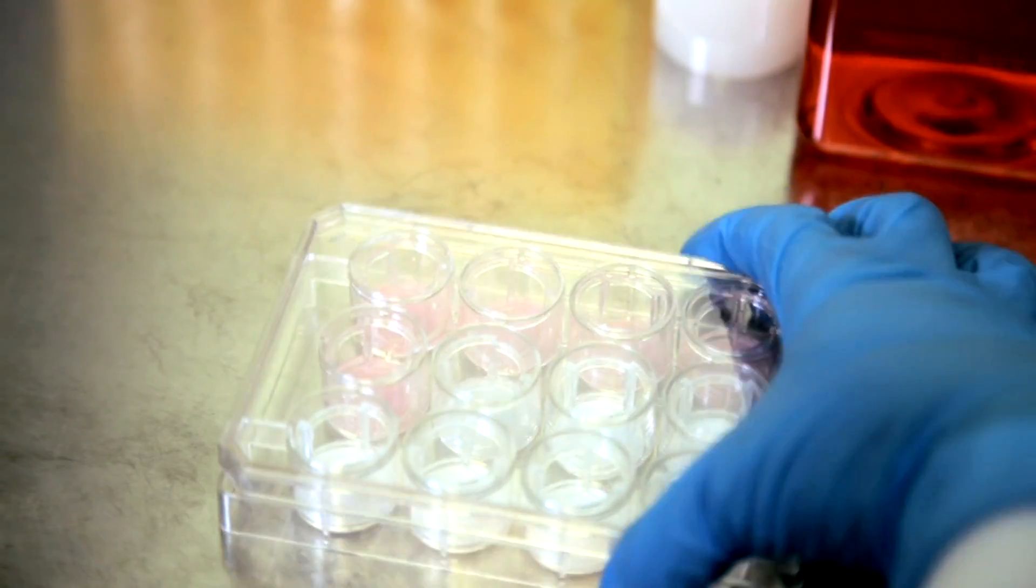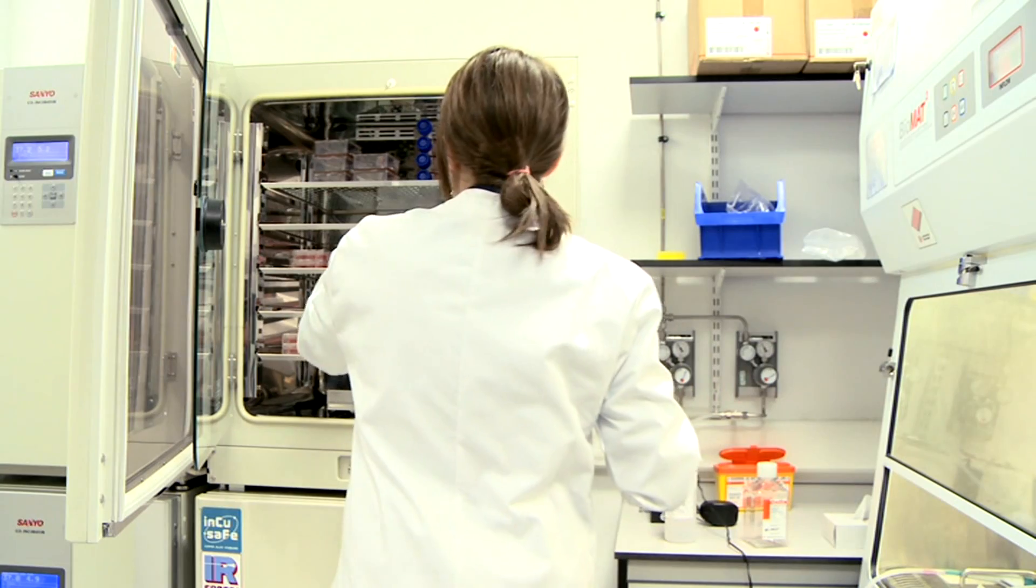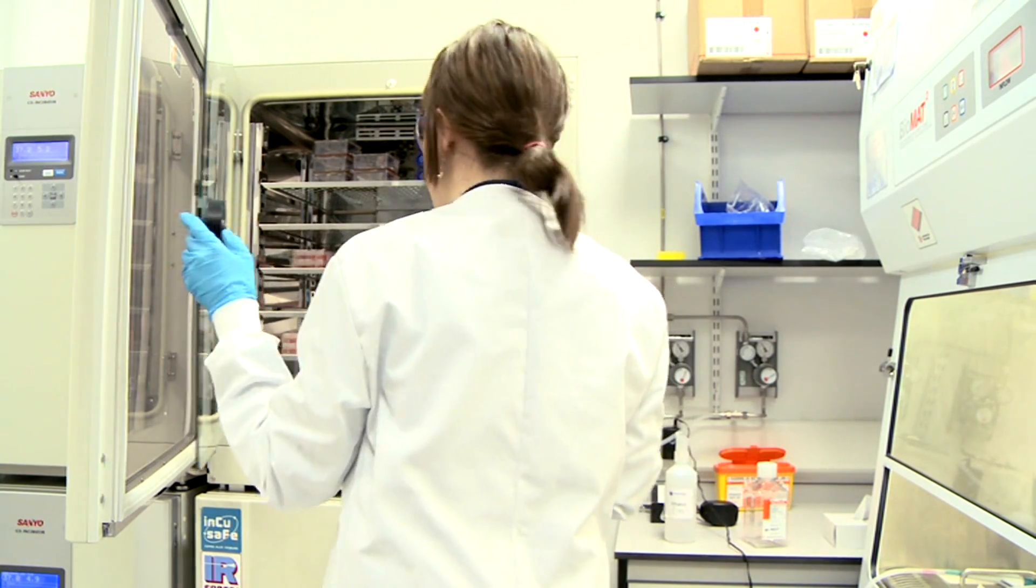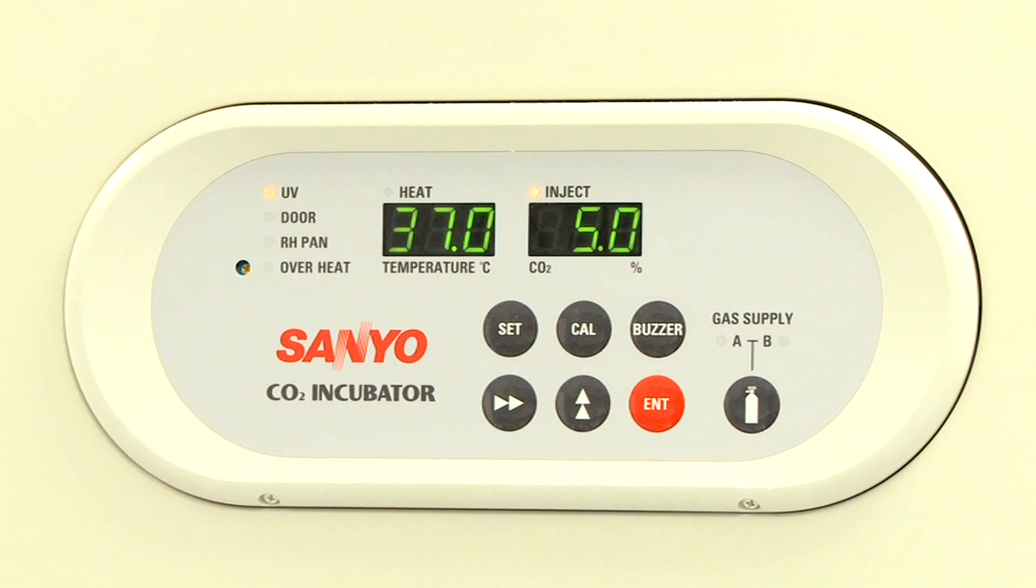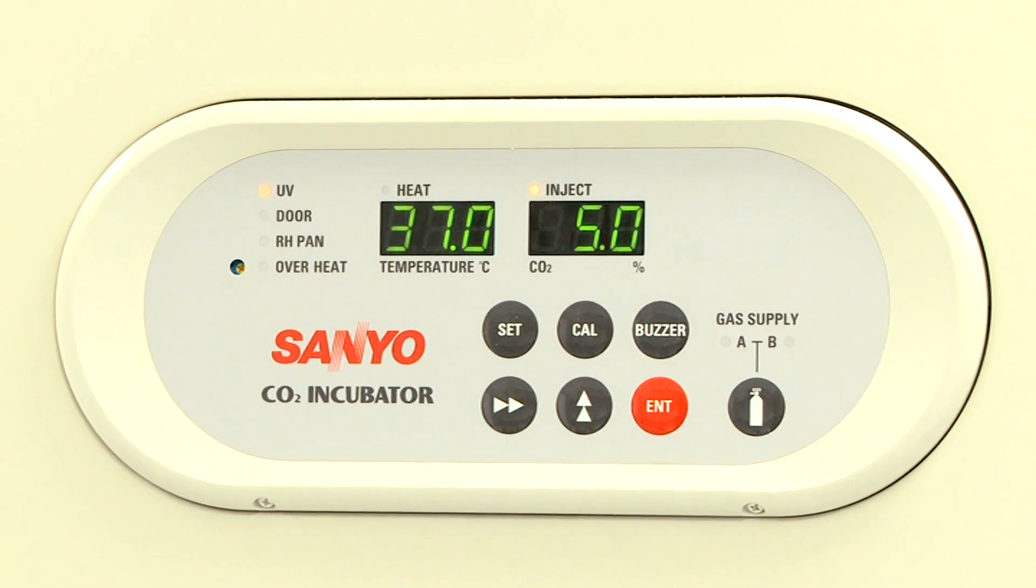Replace the lid and place the plate in a humidified incubator at 37 degrees centigrade with 5% carbon dioxide for approximately three hours. This will facilitate cell attachment to the Alvatex membrane.